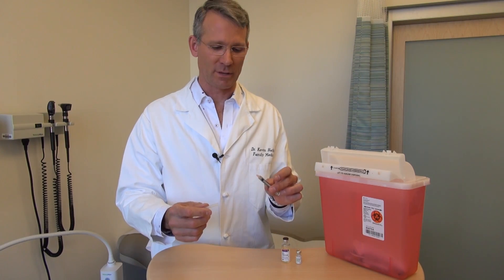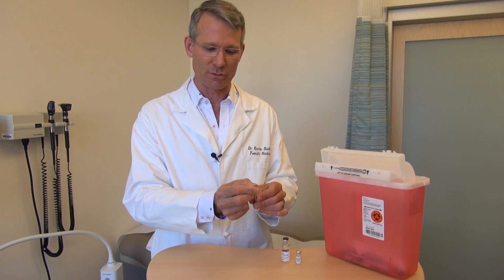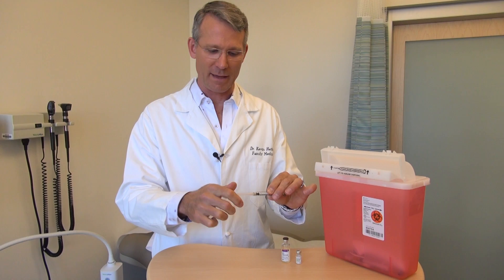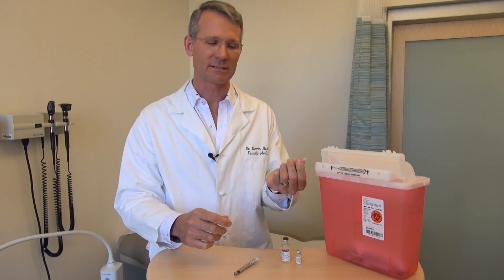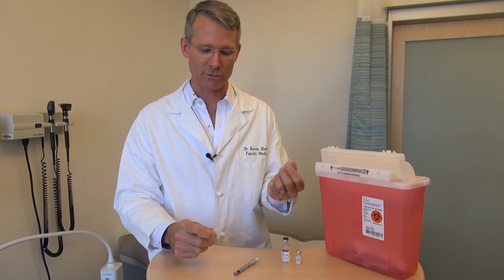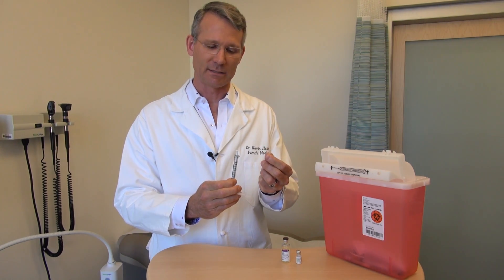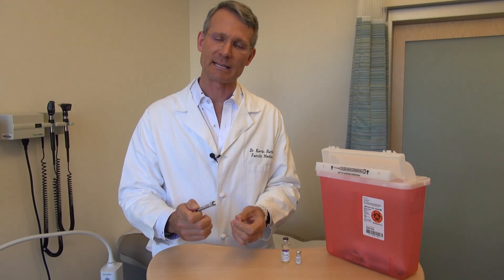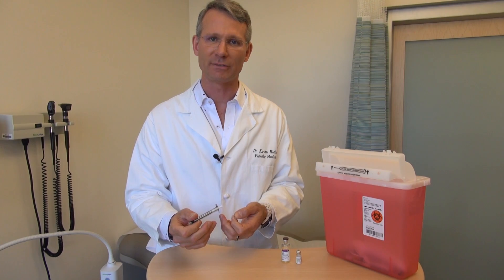Once done, throw the needle into a sharps container. It's a bit difficult to unscrew the needle, but if you put the cap back on you can grip the plastic hub and unscrew it. At home, it's worth throwing away just the needle itself — not the cap or the syringe — so it takes longer to fill up your sharps container. When the sharps container is full, take it to a hazardous waste site; most cities have one, or you can return it to the pharmacy for a nominal disposal fee.